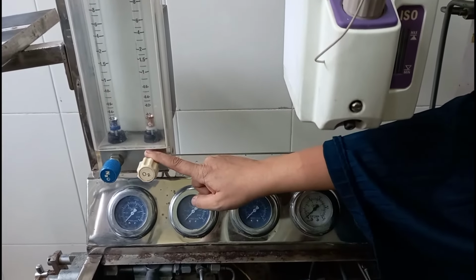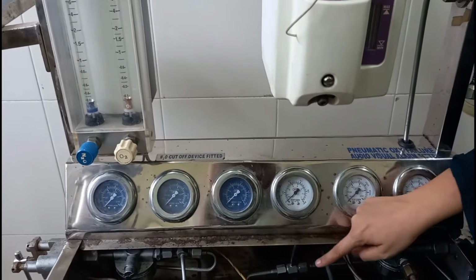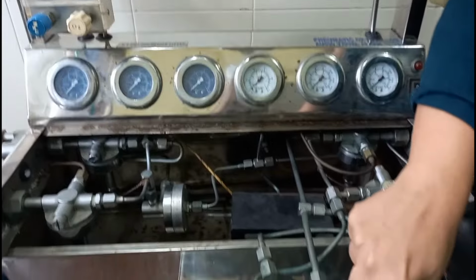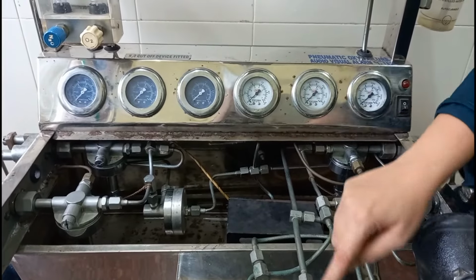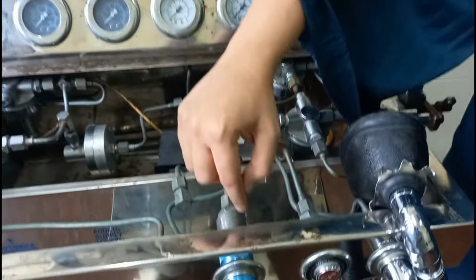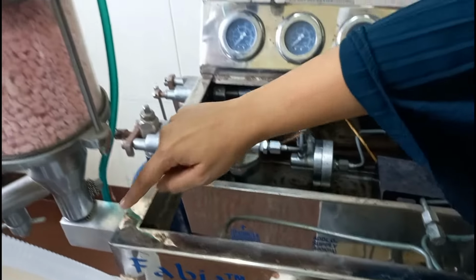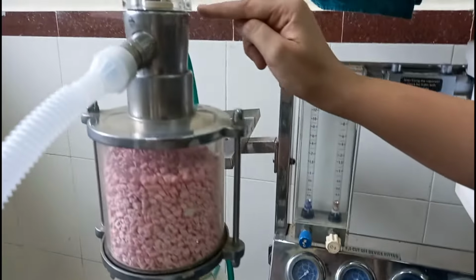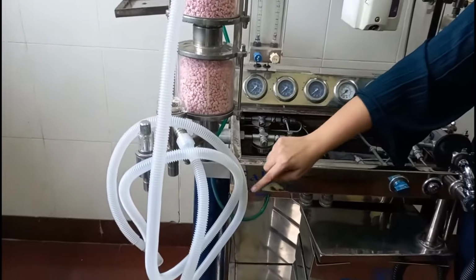It will take the life sustaining gases from here, oxygen and nitrous, and then from here it comes back down, and here is the circuit which switches this machine into open or closed. So from here this is the open circuit, and this part from here going towards this part, there are the soda lime canisters, the gas goes inside this and then into these expiratory and inspiratory valves, then to the patient.